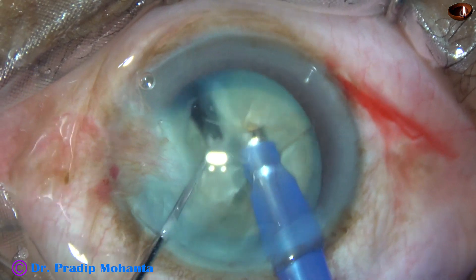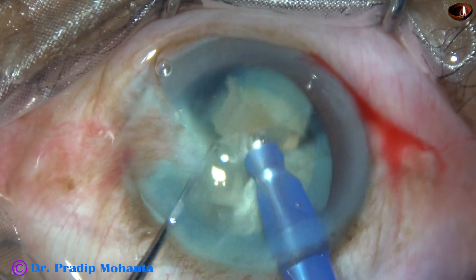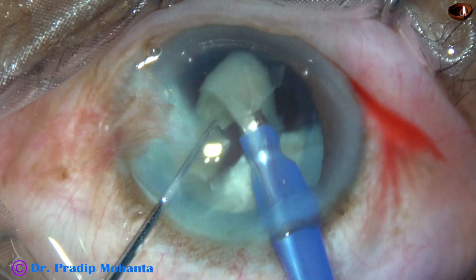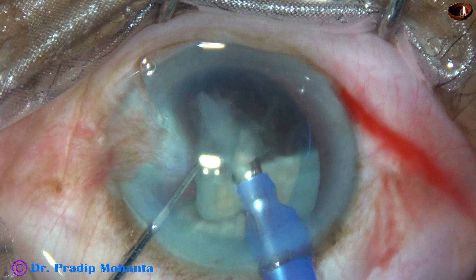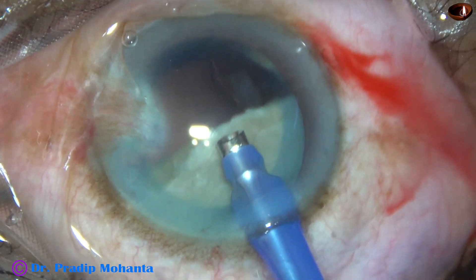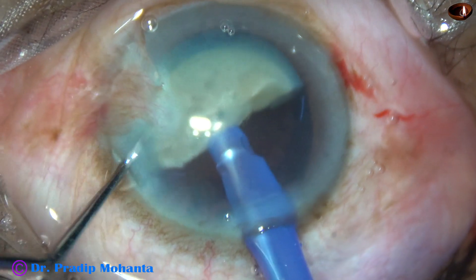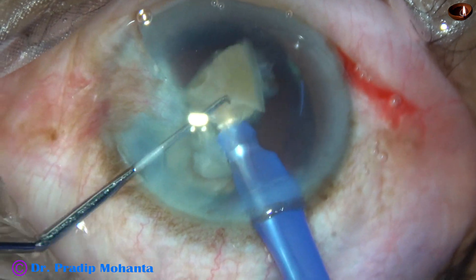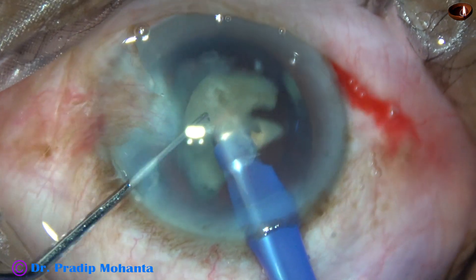Now I make the bevel off and divide the hemi-nucleus in front into three pieces and emulsify the pieces. Ultrasonic energy used in this case is 70%, flow rate is 45 ml per minute, and vacuum is 450 mmHg. Now the other hemi-nucleus is turned and divided into two pieces. In this case, the substance of the nucleus is brittle, not leathery, and chopping was very easy.